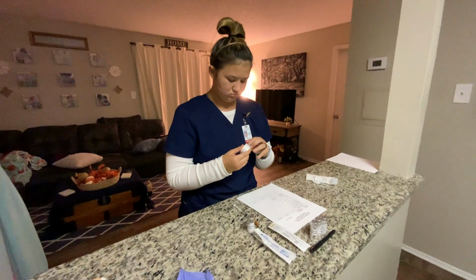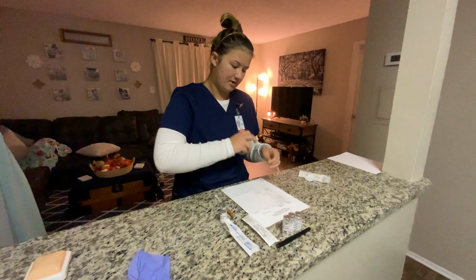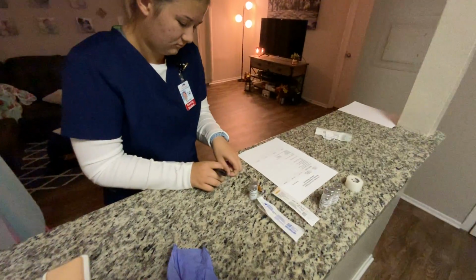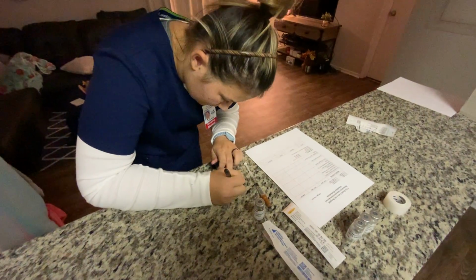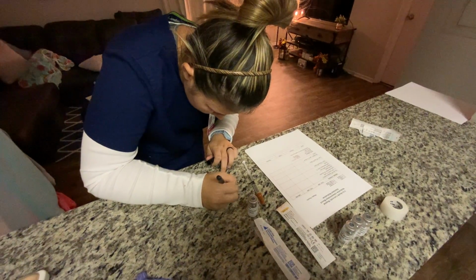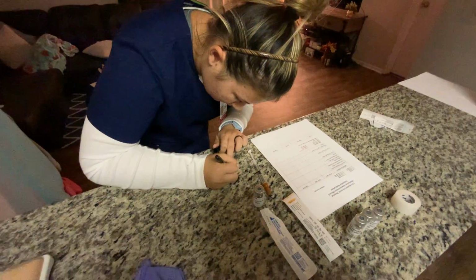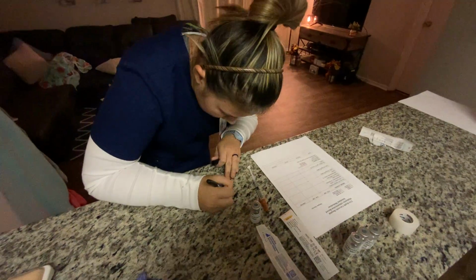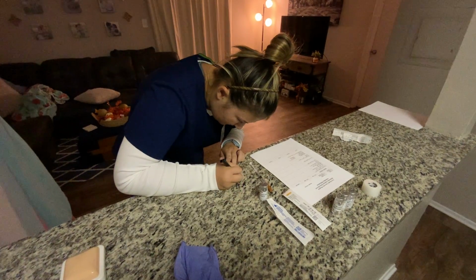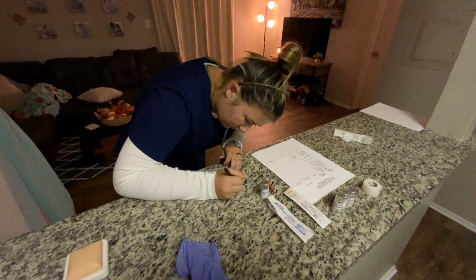I'm going to prepare my label. And on the label, I'm going to have the name of the patient, the name of the drug, the dosage, the route, and the time. So his name is Jaguar J. Jones. I am giving heparin 5,000 units. Subcutaneously. And every 12 hours.